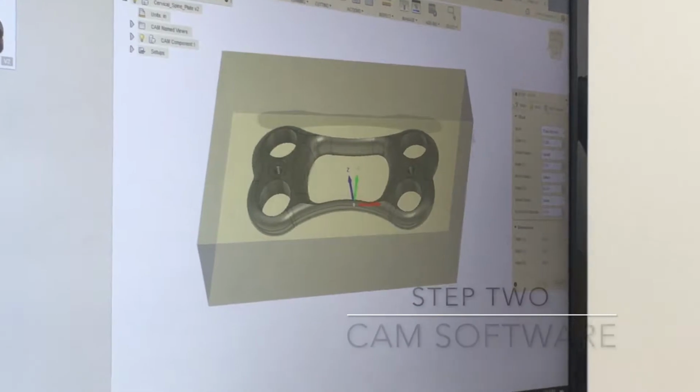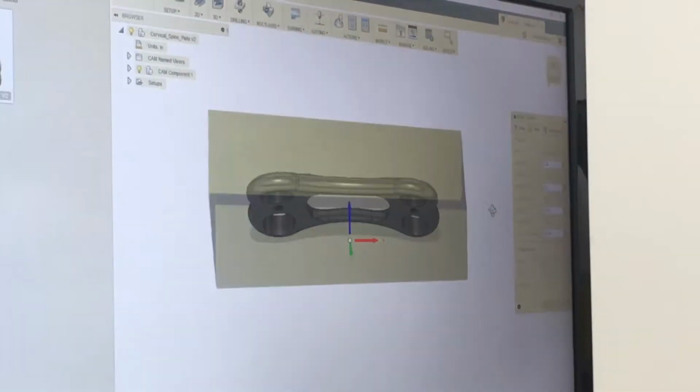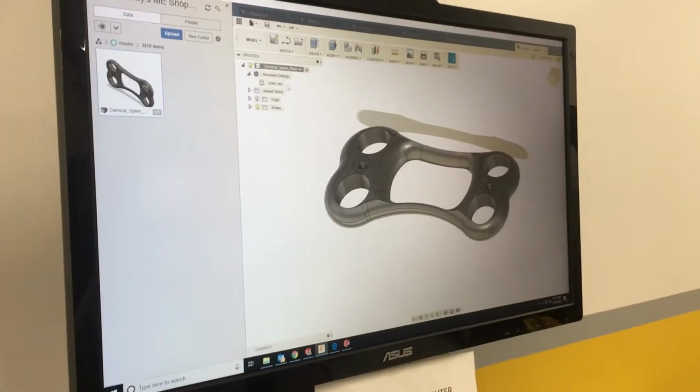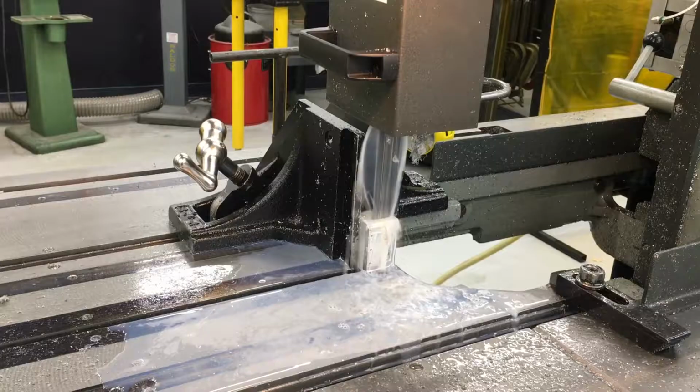Once the CAD file is finished, it is uploaded to Autodesk Fusion 360, a computer-aided manufacturing software. Make sure to put the stock dimensions into the software for reference. The machining process of a CNC mill is then designed and simulated in the CAM software.